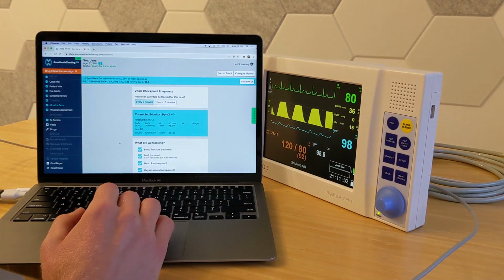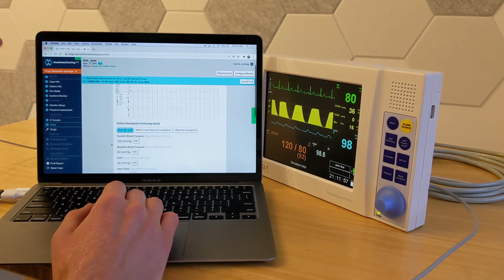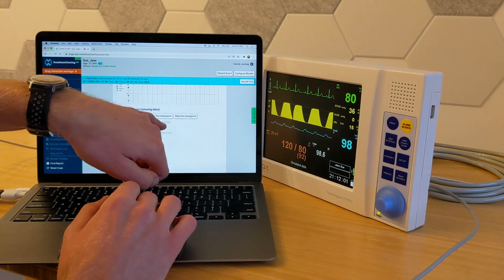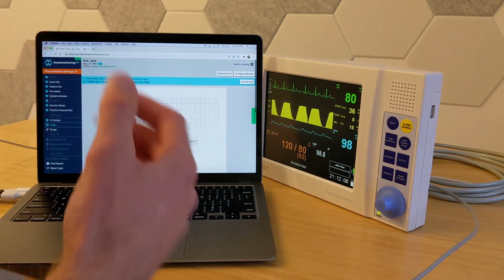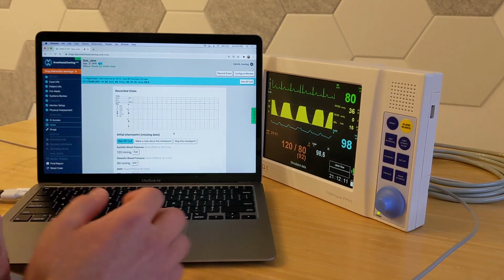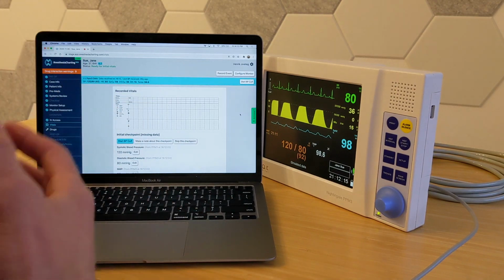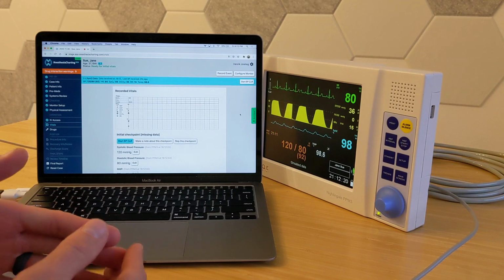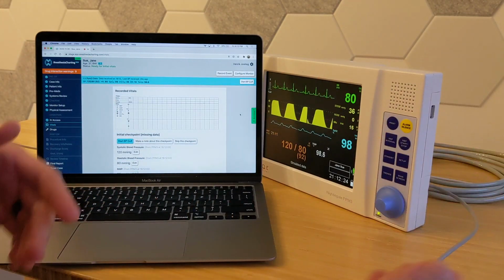What I wanted to show you is actually the vitals page here. So now data is getting populated from the monitor, and it tells you from the PPM3 and at what time it got that measurement for each item here. And then as you start the case, initially for the initial vitals, you can start a blood pressure cuff whenever you want, and we kind of have you do that manually. But throughout the case, 55 seconds before the next checkpoint, before it needs another blood pressure, what it's going to do is it's actually going to start the cuff itself.